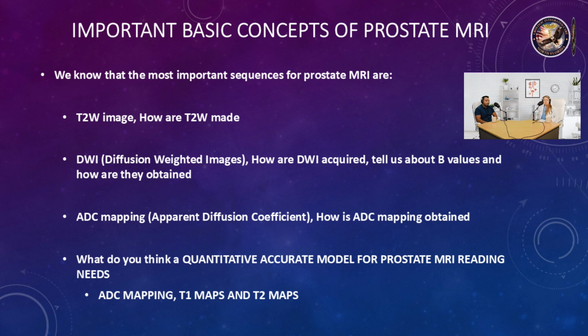These are very important basic concepts of prostate MRI, and we're so blessed to have Dr. Manish. He's brilliant, and I am, aren't I? Okay, he's been a friend of mine for many years. So we're going to have him take over and explain to us what a T2-weighted image is, how they are made, what a diffusion-weighted image is, what ADC mapping is, and what he thinks about an accurate model in the future to make the reading of MRIs more accurate, easy, and straightforward.